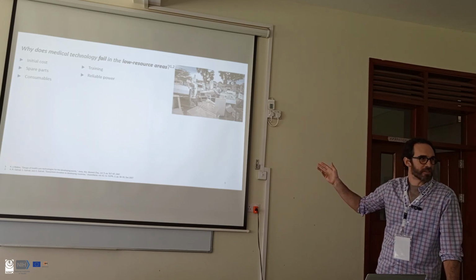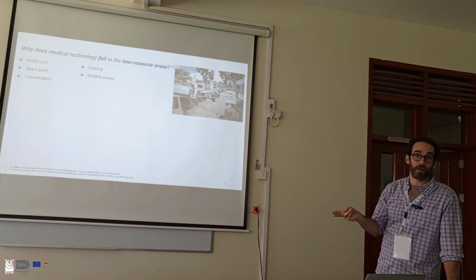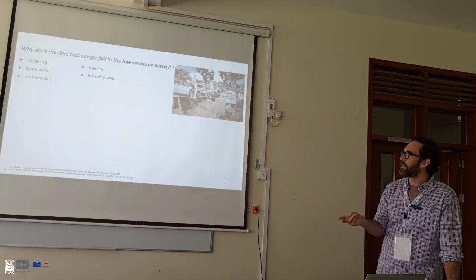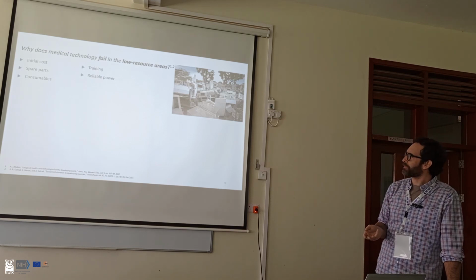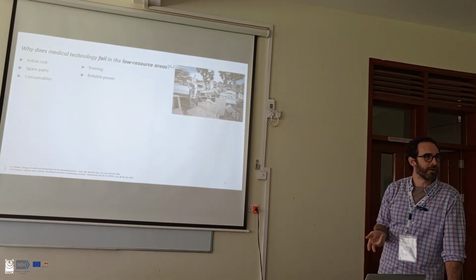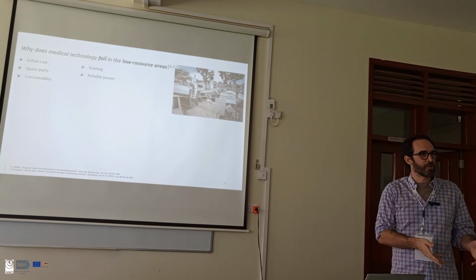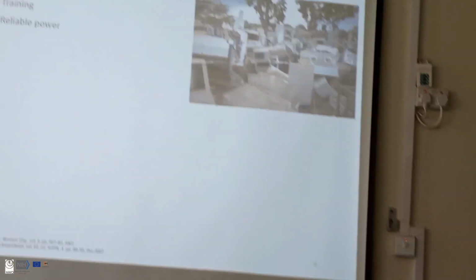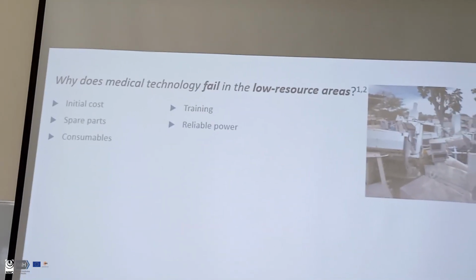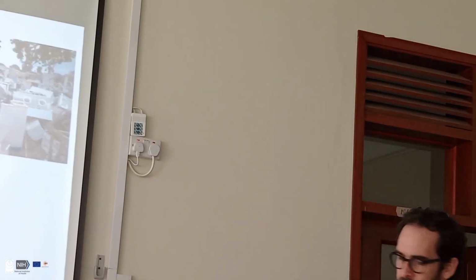And basically it's things that probably all of you know very well. Initial cost is a problem, spare parts is a huge problem, right? Consumables, so for MRI we're thinking liquid helium. Training, reliable power. Sometimes the technology will come in and it won't have a training manual in the language that it's going to. And so even the folks who are perfectly capable of fixing the equipment don't have the information they need to do it. It's really a travesty.